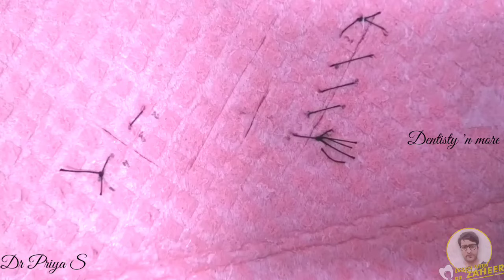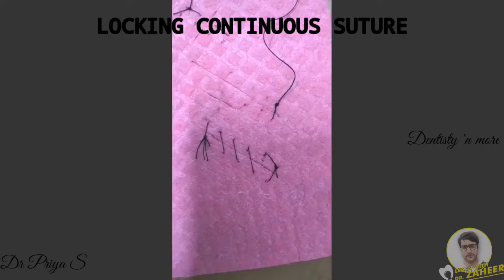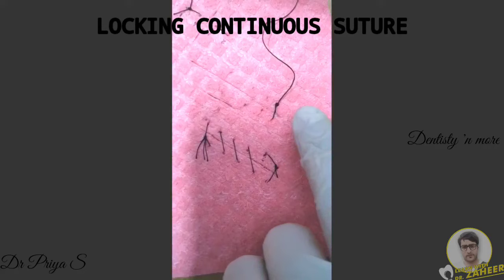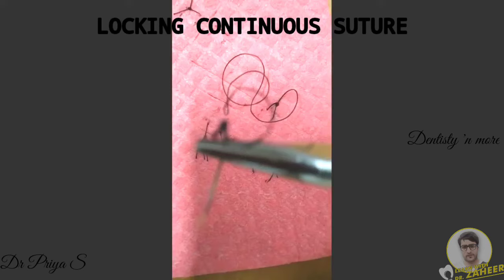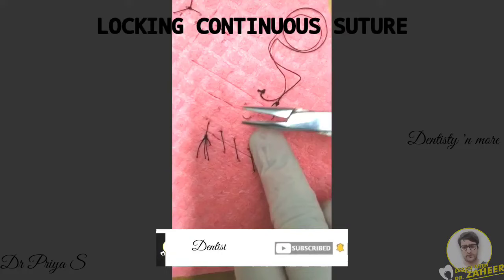This suture is similar to continuous suture, but with the added advantage that a degree of locking is provided by withdrawing the suture material through its own loop. The first step in locking continuous suture is similar to that of simple continuous suture — you make a simple interrupted suture with a surgeon's knot, with the longer end of suture material uncut. Then you go on suturing continuously with each suture placed at a distance of 1 cm from each other.